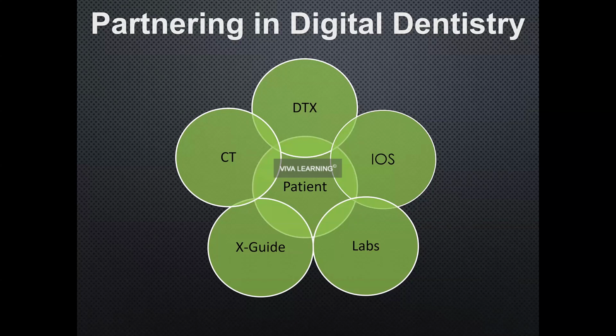With your CT, you obviously will need your intraoral scanner. And you can kind of match up those DICOMs and STL files that you're able to present to the lab to help you make your provisionals, to help you treatment plan some digital workups and such. And then ultimately, in this case, I've been using XGuide as my dynamic navigation, treatment planning, and surgical technology for a little over 5 years now.